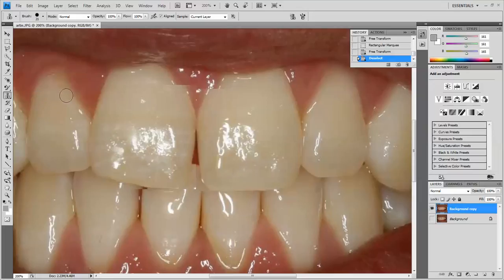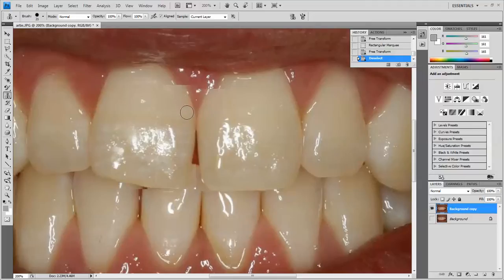Going into that — what this tool allows you to do is sample a particular area of the tooth. You can see the little circle right here. If I push the alt button, it's going to bring up a little bullseye. If I click, that's going to select that as the color. So I can take that sampled color, click it all over the place, and add to it.